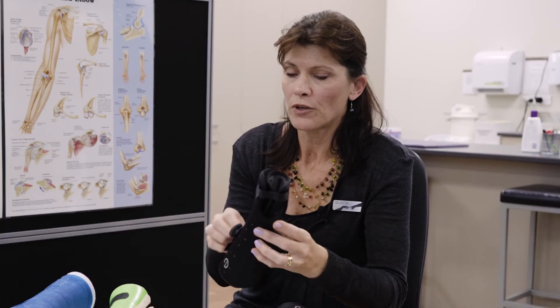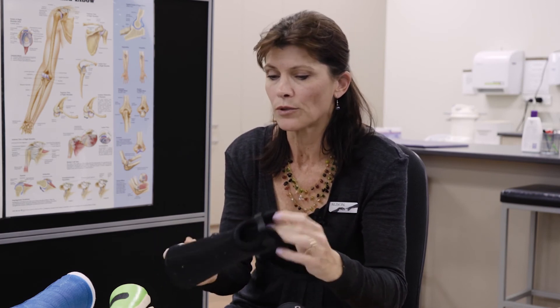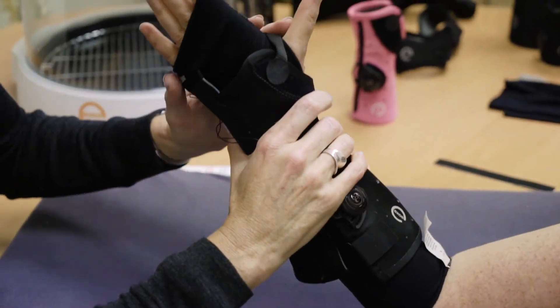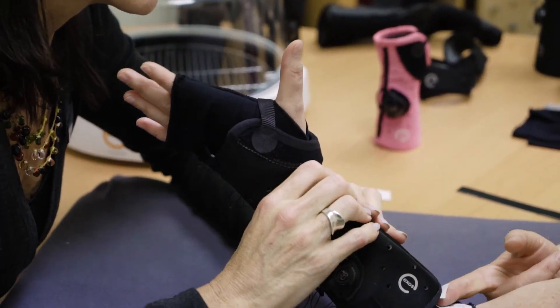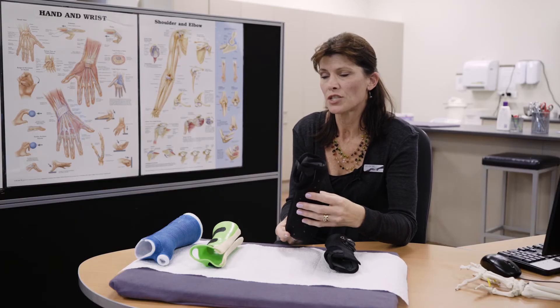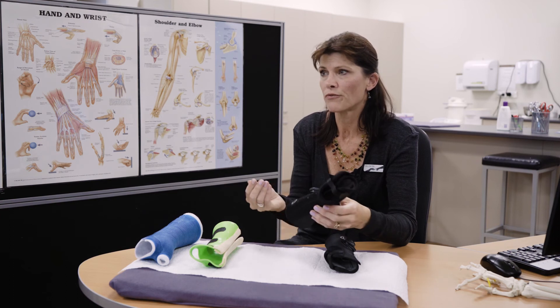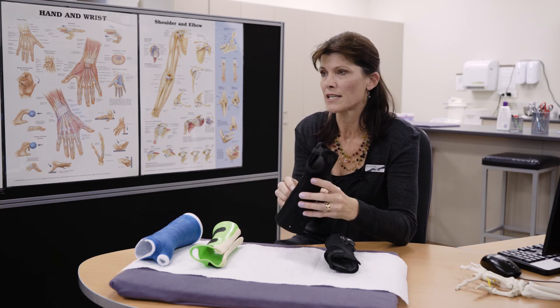It is fully moldable depending on your size, so there are lots of different sizes available. We heat it in an oven and then mold it directly onto you. It's really hard-wearing and it's waterproof, so you can shower with it on. You can still go swimming — you just need to loosen it off, dry underneath it, and tighten it back up.